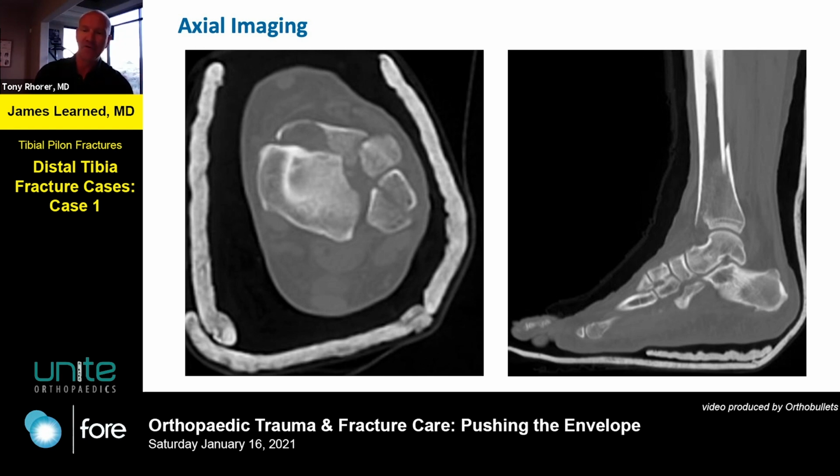So I always put a pin in the talar neck, right in the middle of the talar neck medially. That's super hard, dense bone. It can accommodate a 5.0 millimeter pin pretty easily. Then you can build that out to a transcalcaneal or calcaneal pin, and you have dramatically more control over the distal end of the tibia, and you can pull pretty good pressure on that and at least make up half of that difference.